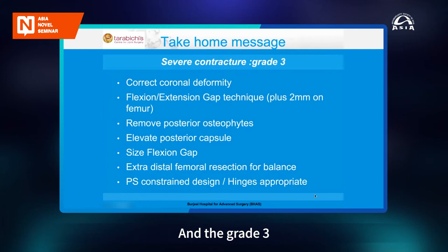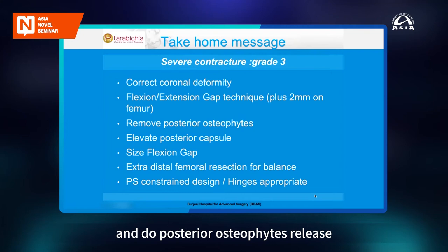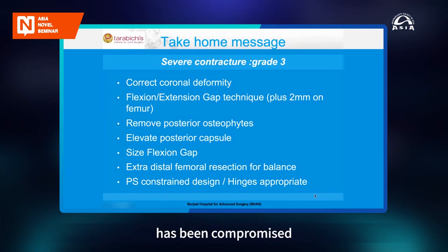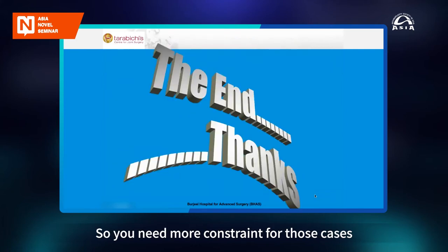And for grade 3, you have to address again the varus and do posterior osteophyte release. And you have to do a symmetrical flexion and extension gap. But in a very severe case, you will discover that your collateral ligament has been compromised after you straightened up the leg. So you need more constraint for those cases.